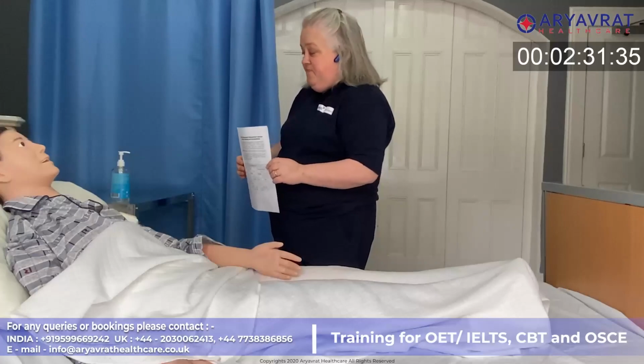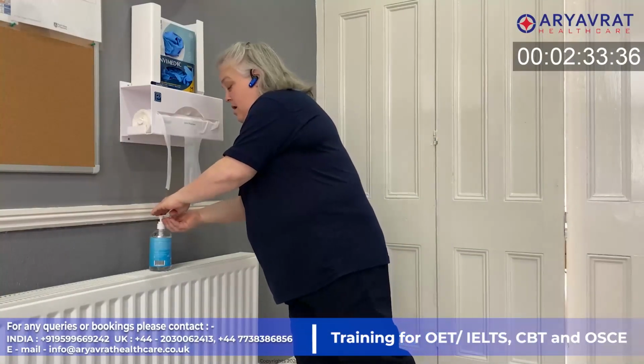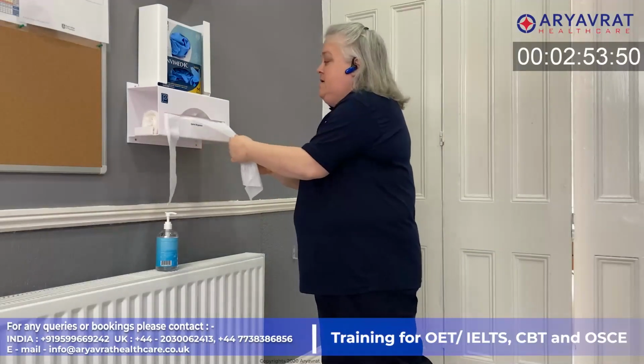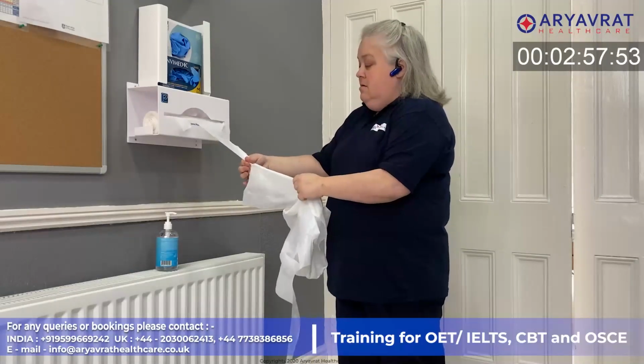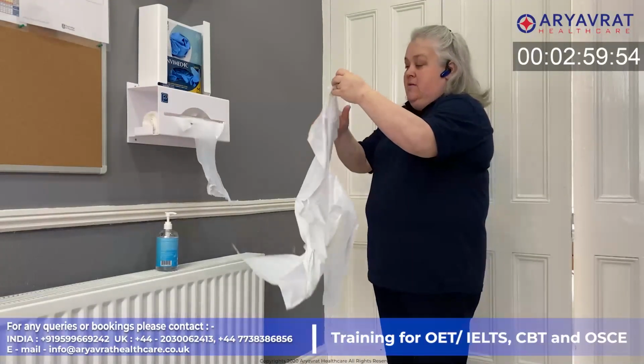Is that okay? Okay. So I'm going to do my hand hygiene. If there was a sink available, I would do a full soap and water wash, but as not, I'm going to use a hand gel just to make sure my hands are clean before grabbing my apron.